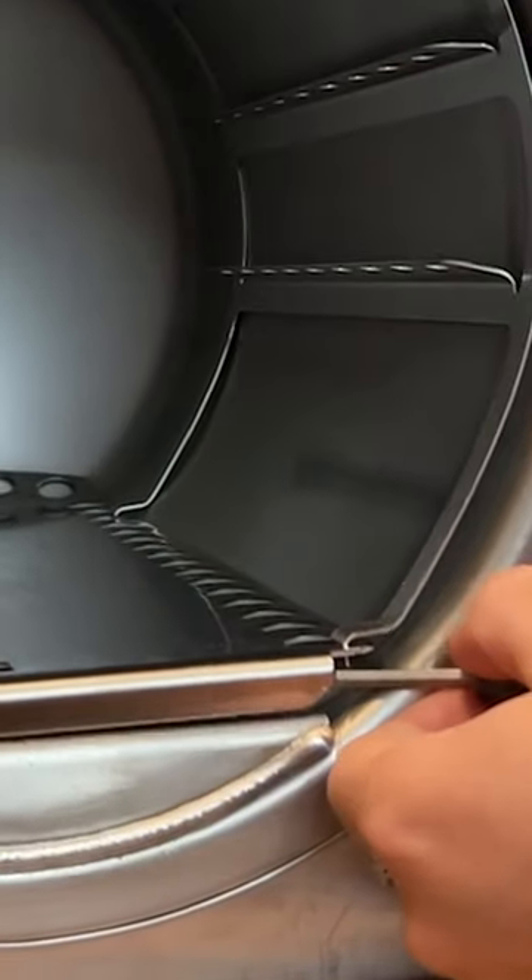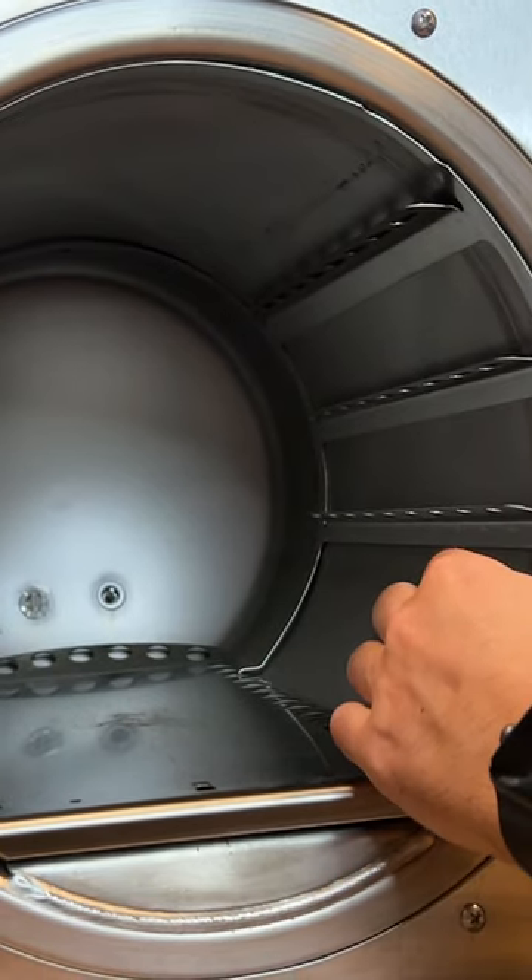Use a little screwdriver, push it right here — you see it slide forward — and you're just able to grab it and pop it out.